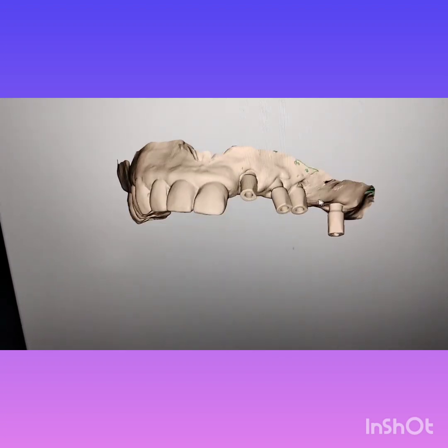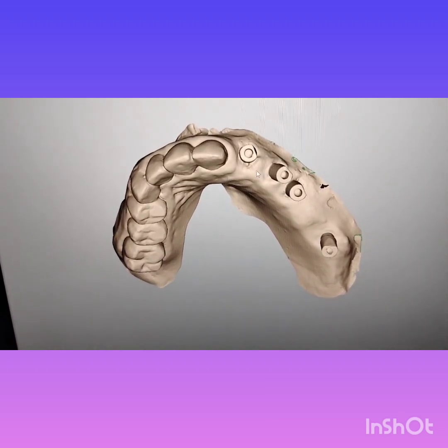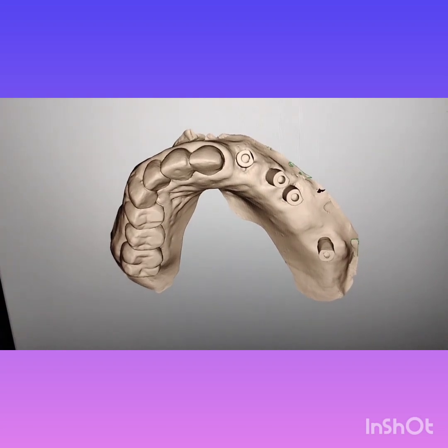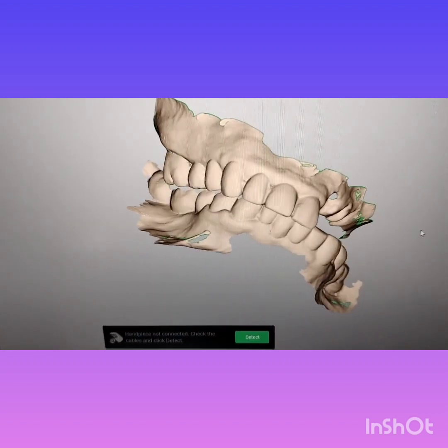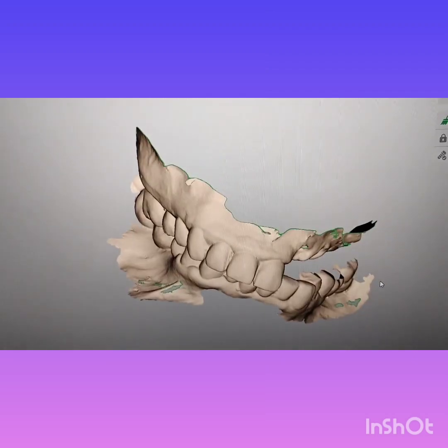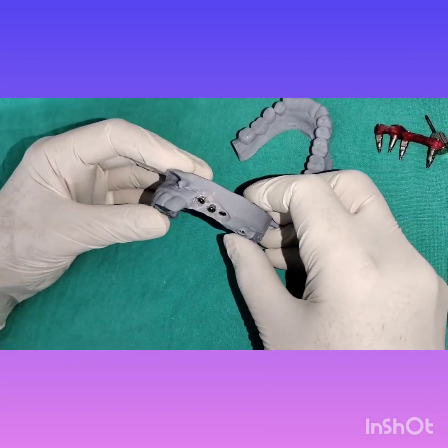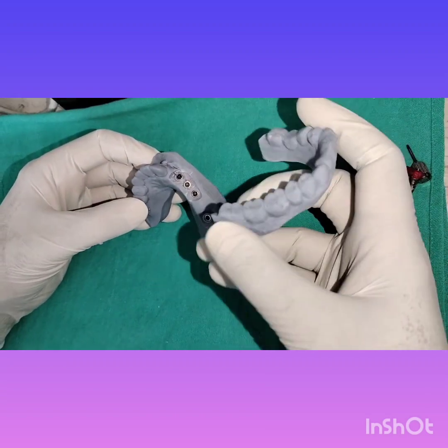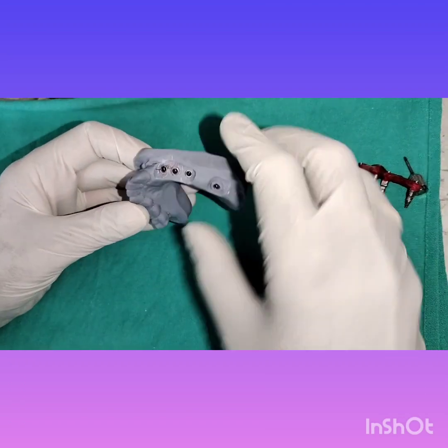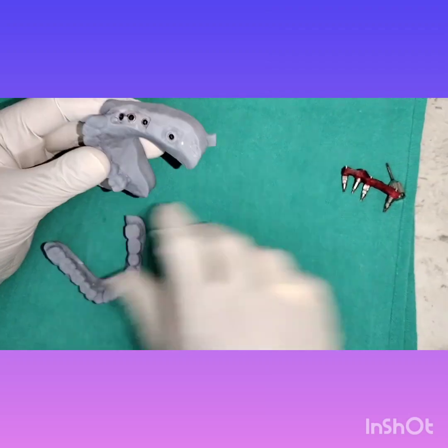Once we have made the intraoral scanning of the upper and lower arch and the bite, we have the 3D models prepared like this. These are the 3D models — you can appreciate them and see the positions of the implants.